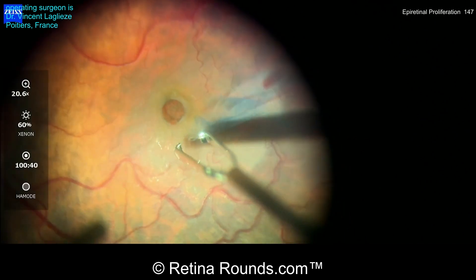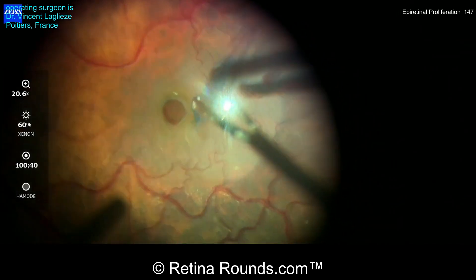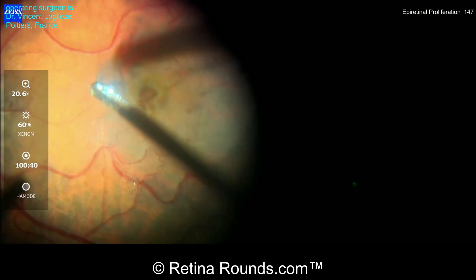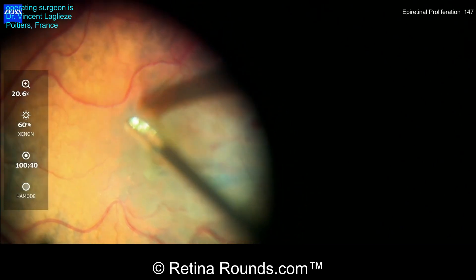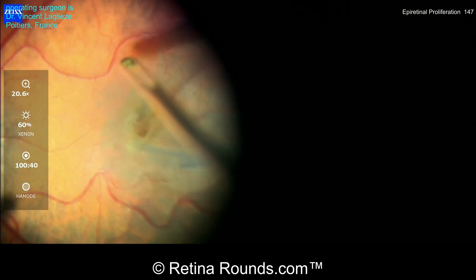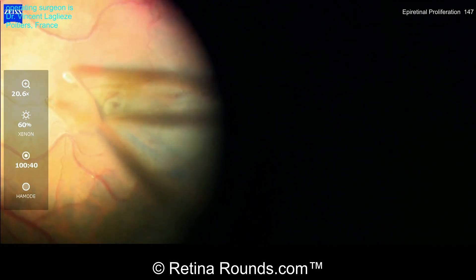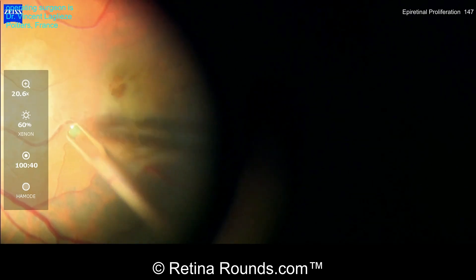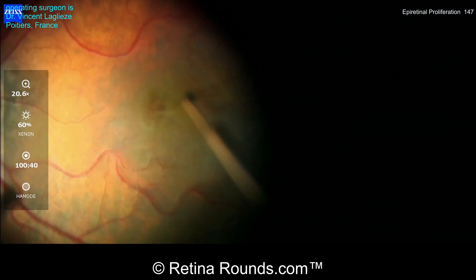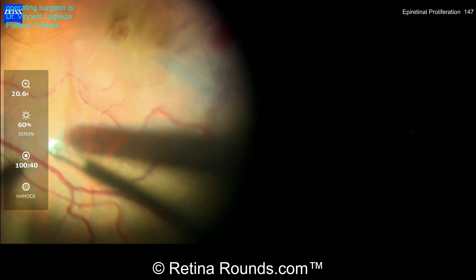That peeling is going to extend more centrally up to the edge of the macular hole. You can see that this tissue has a sort of spongy, thickened characteristic, which is very typical for epimacular proliferation. He's extended the peeling up to the edge of the macular hole, but has not actually removed that epiretinal proliferation. The epiretinal proliferation is being elevated and pulled towards the center of the macular hole, but is not being amputated, not being completely removed.